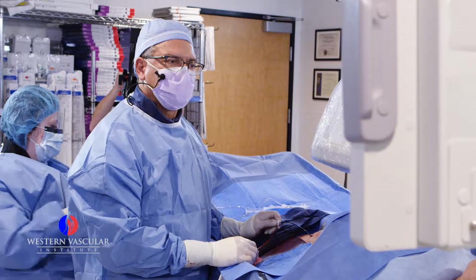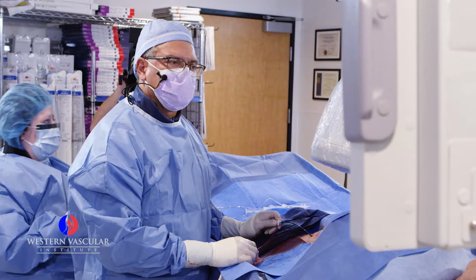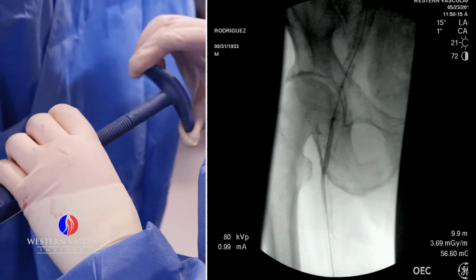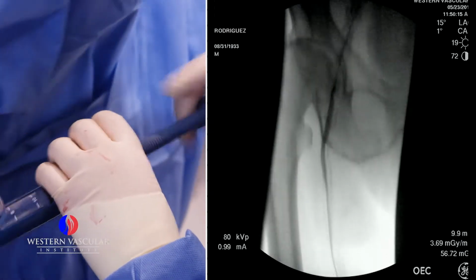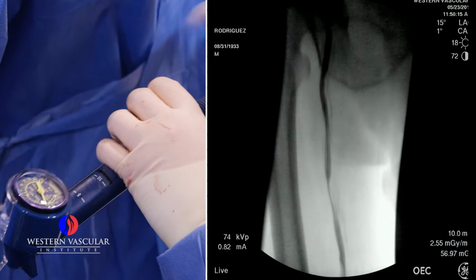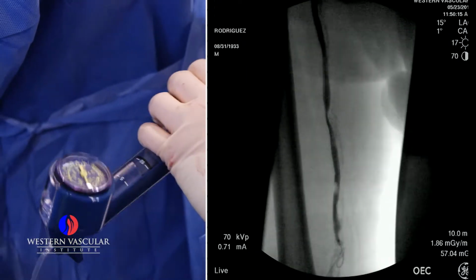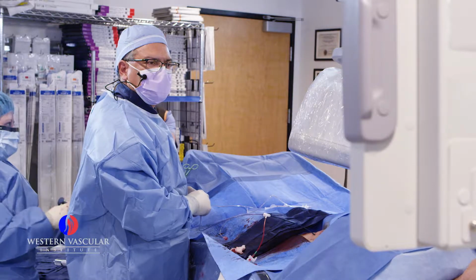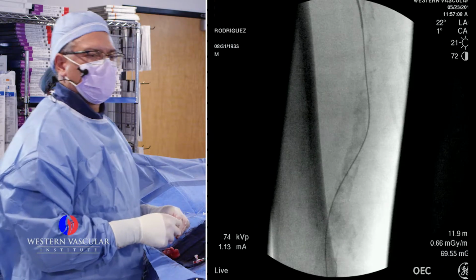This is maybe a big artery. It's between 6 and 7 millimeters. You can see the dye coming up to 12, please. You can see the waist in some areas. If you go down right there, very tight blockage there. All right, down. All right, follow the wire.